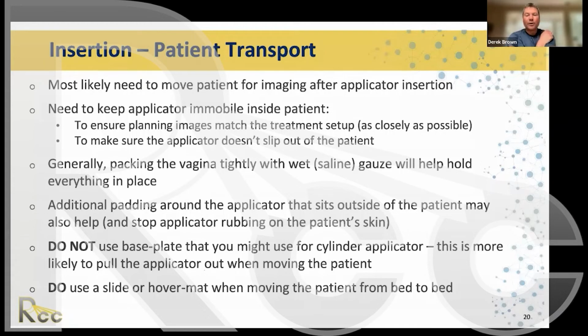Just packing. You can also use gauze to wrap around the device and then wrap that gauze around the patient's shoulders, almost like suspenders. I know people have designed underwear that will do the same sort of thing.